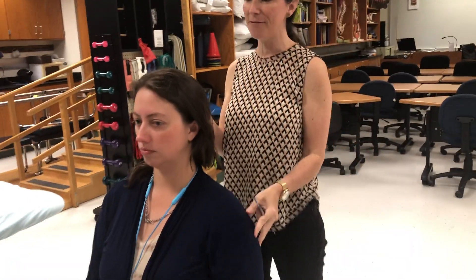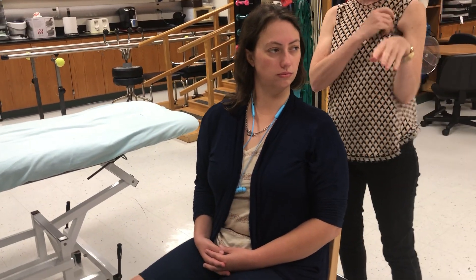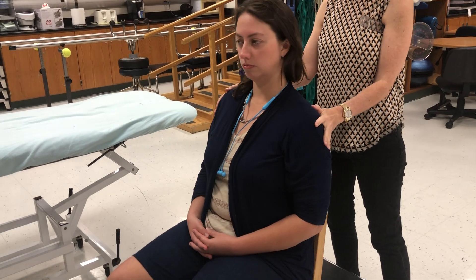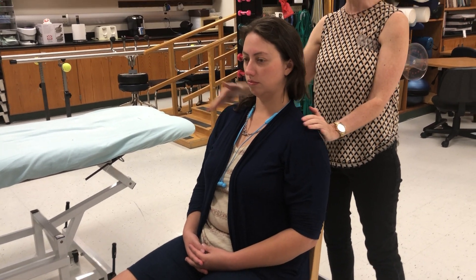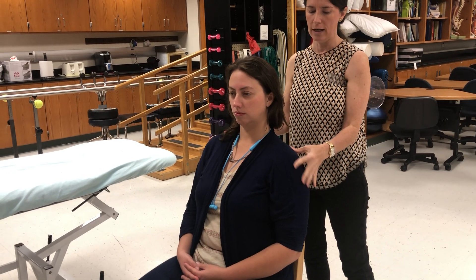A common compensation you might see — if someone has limited left rotation of the cervical spine, she might start to rotate the rest of her trunk. So I would say: hold on, you're rotating your trunk. I put my hands at her shoulders, maybe anteriorly on the right and posteriorly on the left, to prevent that extra motion from happening.